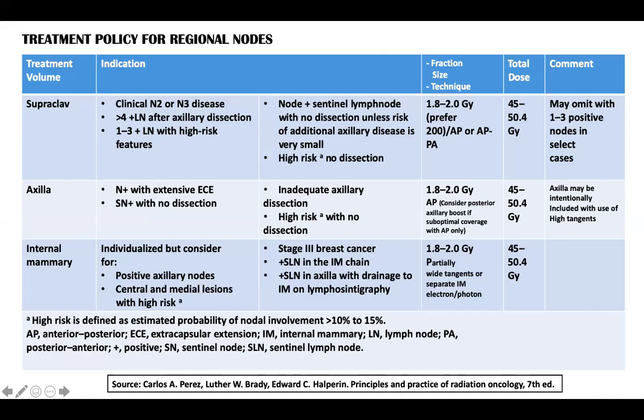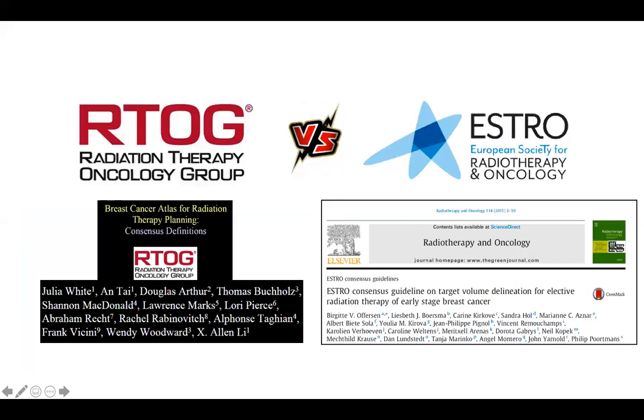But Indira, as you summarized in your presentation, the RTOG field is in general bigger than ESTRO, except for the internal mammary. Now, what is the philosophy behind it? I hope it will be discussed tomorrow. But can you give a hint? Sir, RTOG follows the bony landmarks and the muscles, so it generally takes a bigger volume. Whereas ESTRO is vessel-based.